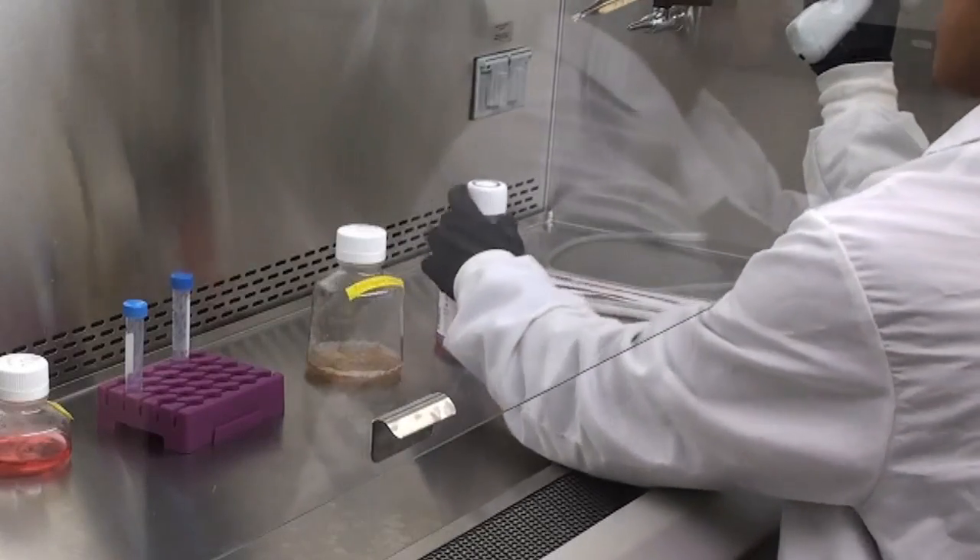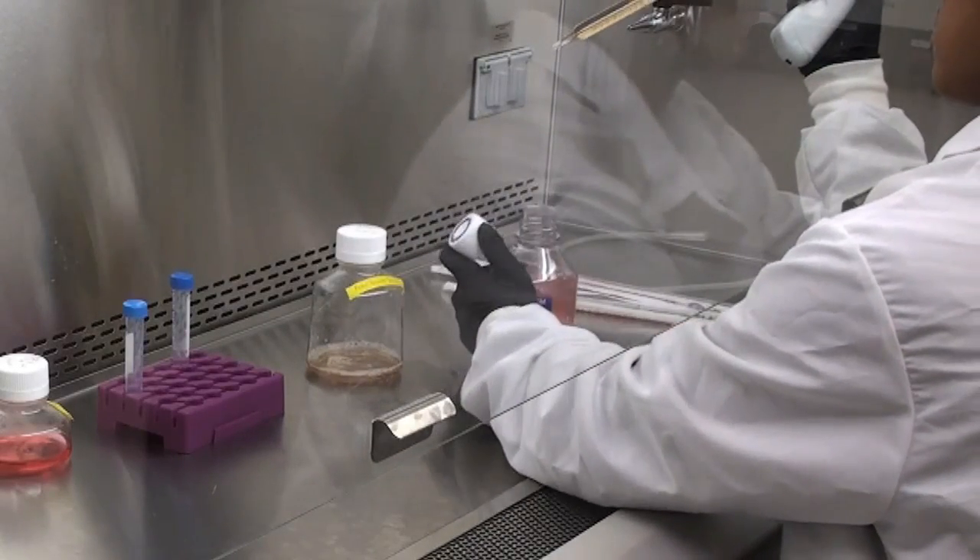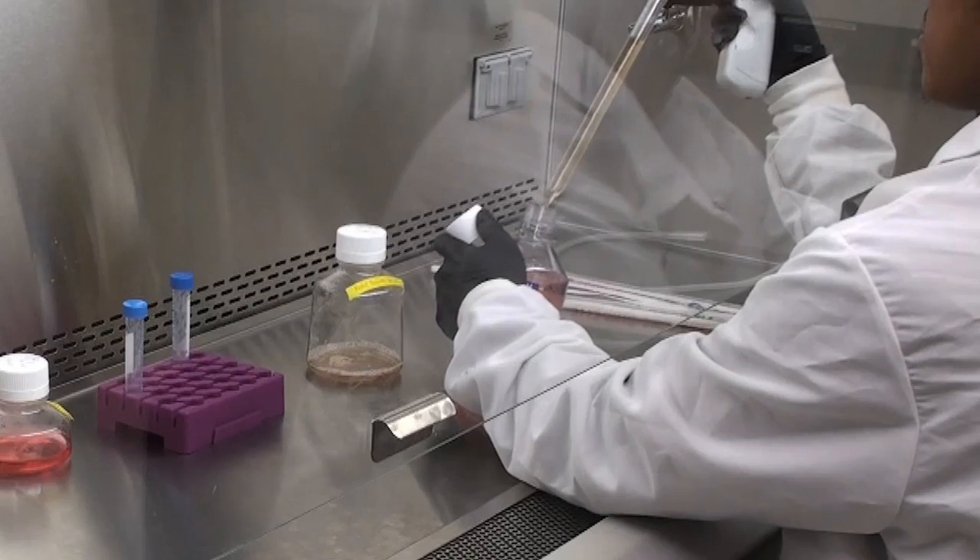When inserting the pipette into flasks or bottles, make sure the pipette tip only touches the inside area. If it touches the outside area, discard it and use a new pipette.